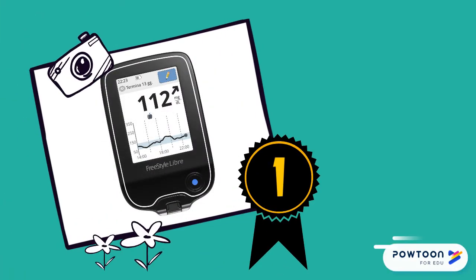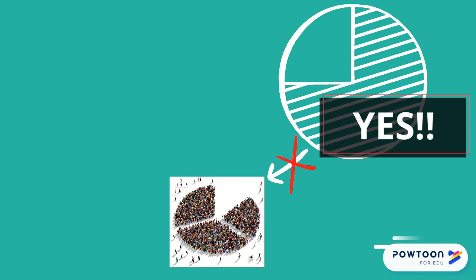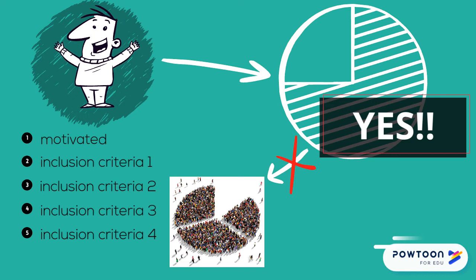So you can possibly guess that by using sensors, it is much easier to keep glucose levels under control. But is this correct? Many randomized controlled trials suggest that this is indeed the case. However, these conclusions are not generalizable to the broad population of people living with type 1 diabetes, because these trials only include participants who are very motivated to do well and who meet very strict inclusion criteria.